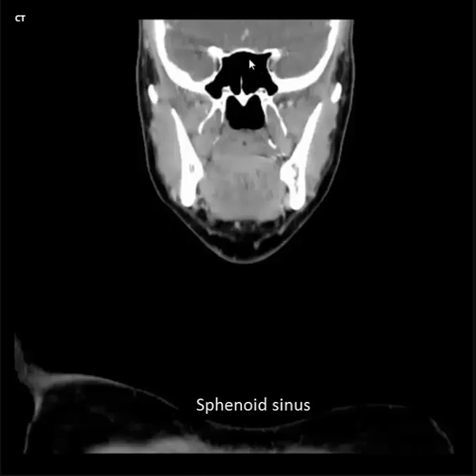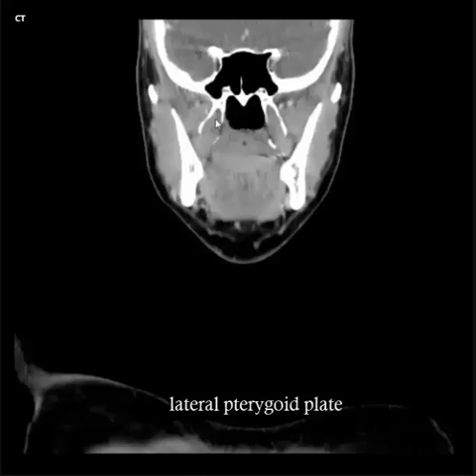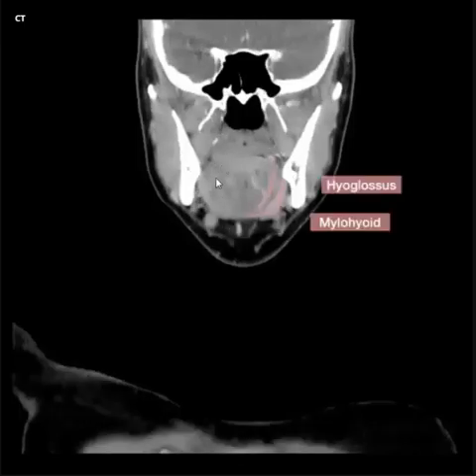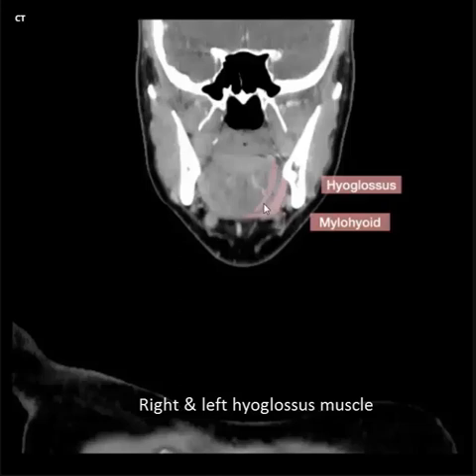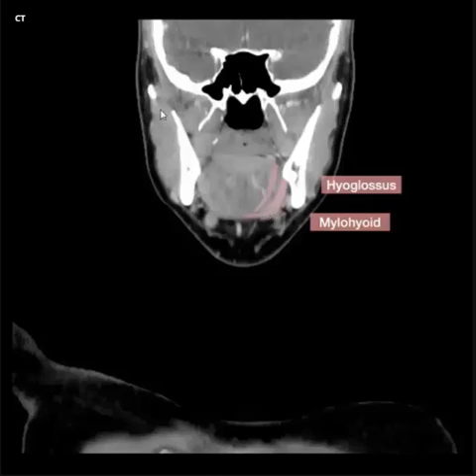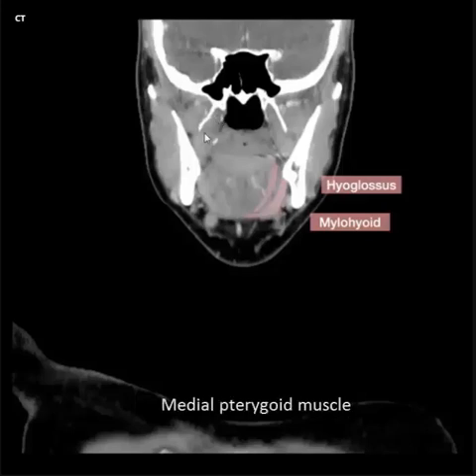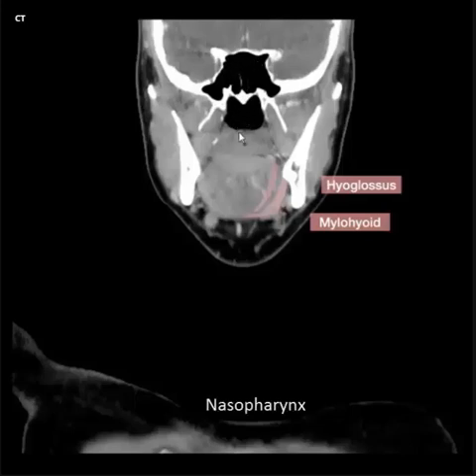Sphenoid sinus, nasopharynx, lateral pterygoid muscle, medial pterygoid muscle, lateral pterygoid plate, medial pterygoid plate, right and left pterygoid muscle. Right and left mylohyoid muscle, right and left masseter muscle. Lateral pterygoid muscle, medial pterygoid muscle, lateral pterygoid plate. Sphenoid sinus, nasopharynx.